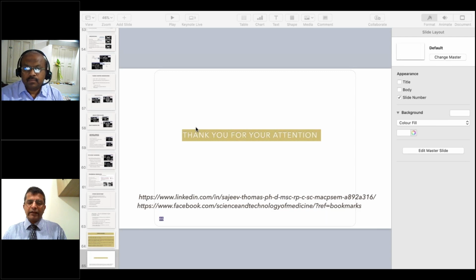But the CyberKnife has a high energy source, and it also has a robotic arm, which needs a limit on its weight to ensure the positioning of the device. So that may be the reason why the scattering from the CyberKnife and the scattering or leakage from the Gamma Knife are much different.